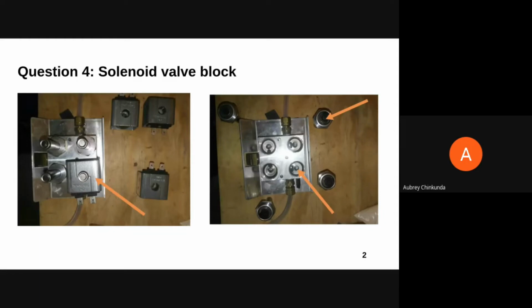Clean the pipes thoroughly so that you no longer have blockages within the air pathways. After cleaning the manifold, reassemble the valve block, and if everything has been thoroughly cleaned, your valve block will come back to normal operating conditions. Even though you suspect that the problem could be with the solenoid valve, the other problem could be that the exhaust muffler must have been blocked.